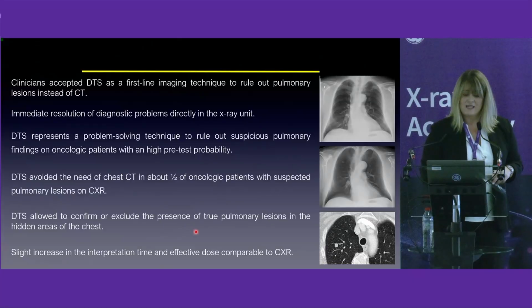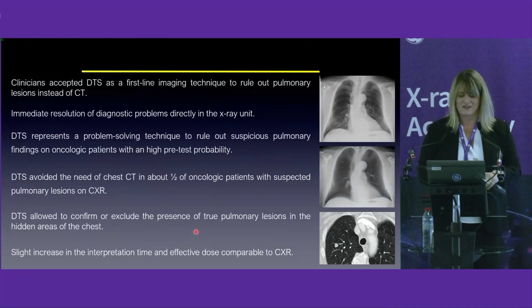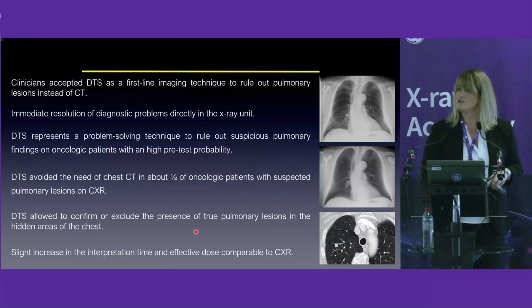Then, DTS allowed to confirm or exclude the presence of true pulmonary lesions in the so-called hidden areas of the chest, with a slight increase in the interpretation time and effective dose in comparison with chest X-ray. And so, I finish.